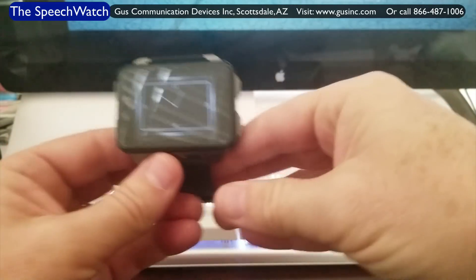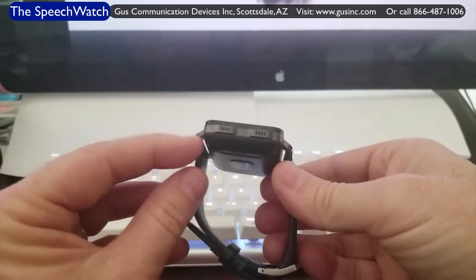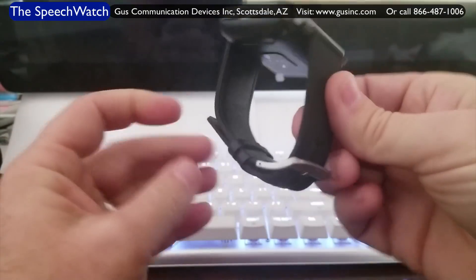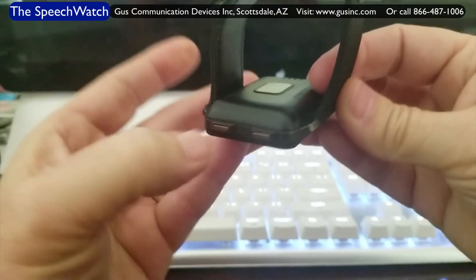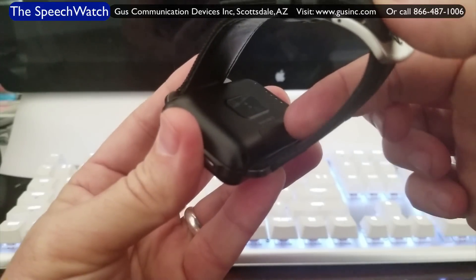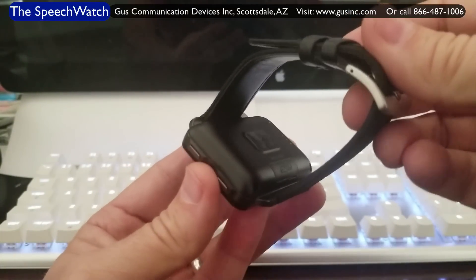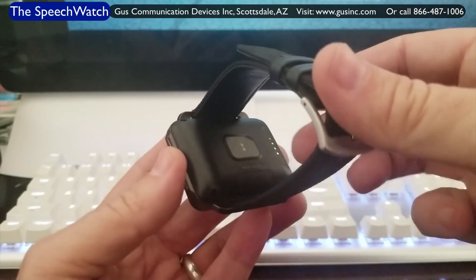Now let's take a tour of the watch. Looking down the left-hand side, there's a microphone and a speaker. This is a smart watch, so you can use it as a full cell phone. If you flip it over to the back side, there's an opening where it lifts off and you put your SIM card in. So this becomes a fully functional cell phone — you can use it for texting, making phone calls, GPS tracking, finding restaurants, everything you do on your phone.